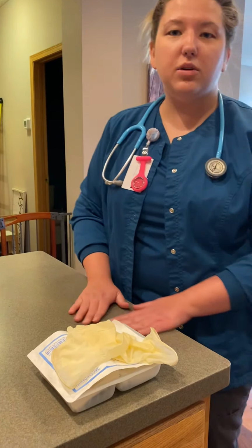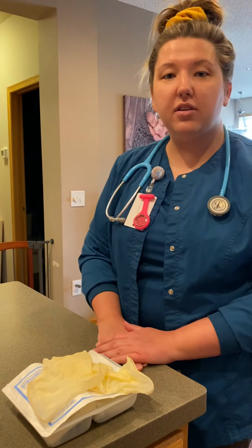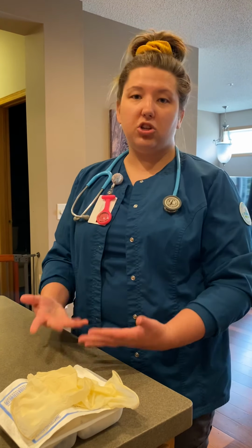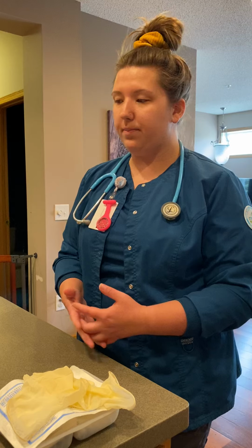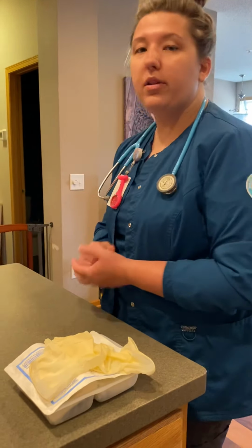I'm also going to ensure that I have the appropriate PPE based on my facility's policy, so I may need a face mask and a face shield. So I'd ensure I would have those supplies also. So I'm going to check to see if I have an order, which I'm going to pull up in the MAR here to see if I have an order for that, and we got it. So I got the order, and I'm going to go in the patient's room.